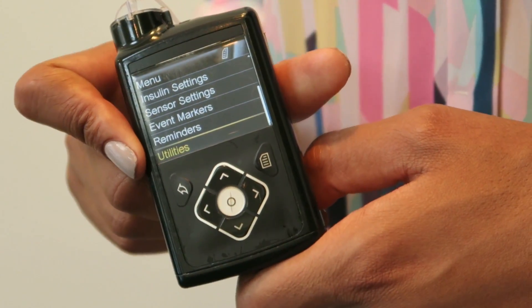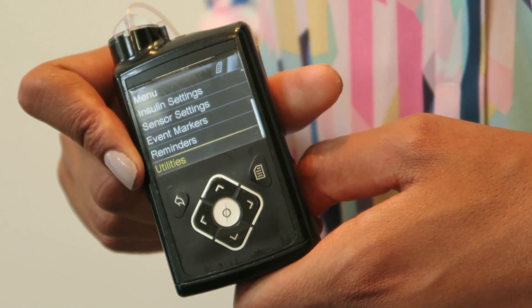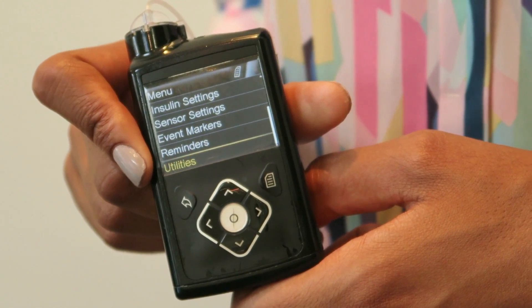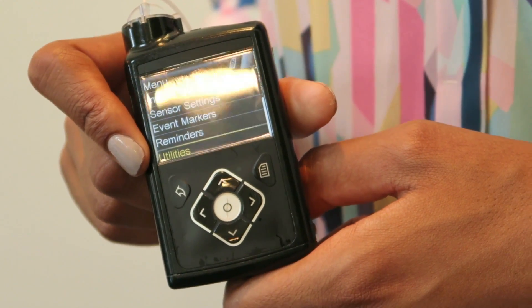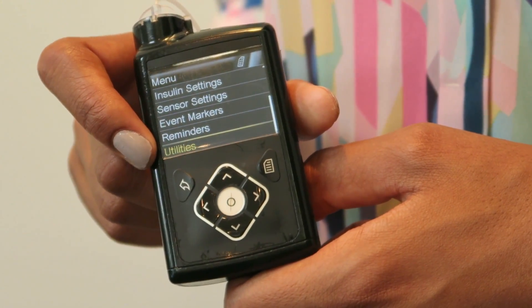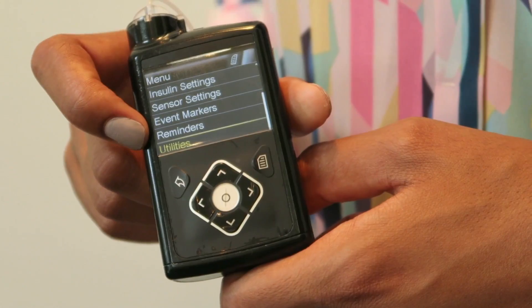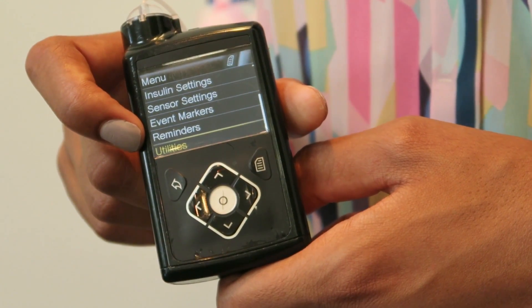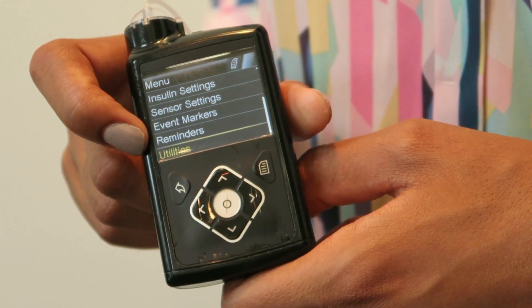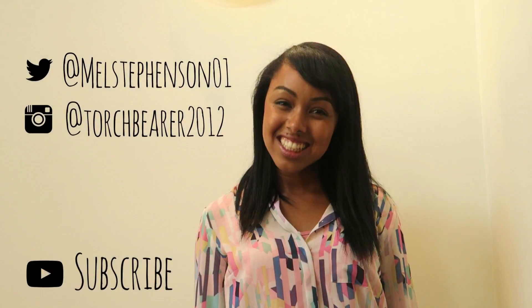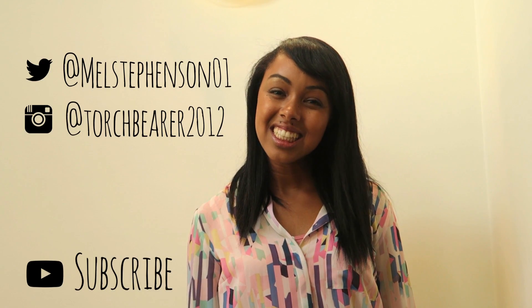And finally you've got the utilities — similar to what you'd find on a mobile phone, you can choose how long the pump is lit for or change the time and date.